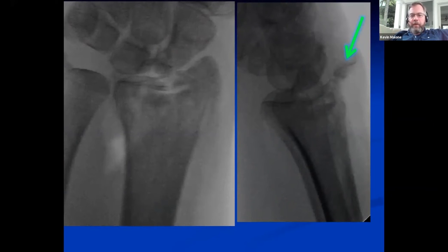This is a dorsal approach with an open capsulotomy. I like to put Hohmann retractors underneath the proximal carpal row to distract and really see the articular surface, then elevate the articular surface. This is going to need bone graft underneath it to support it. With her bone quality, I might do some minimal internal fixation and then potentially stabilize with a dorsal spanning bridge plate, which will allow early return to activities of daily living without undue force across that articular comminution. That of course requires a second surgery for implant removal several months later.